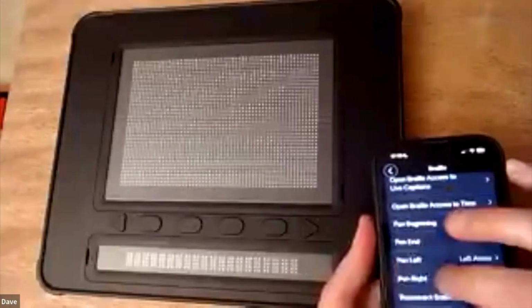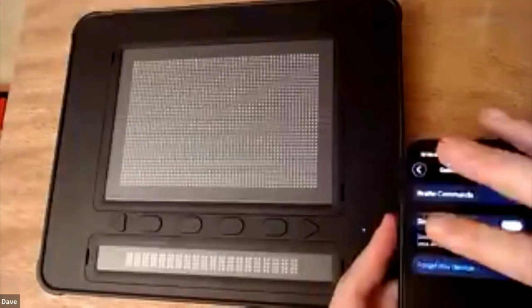So let's go and do that now. I'm just going to do a two-finger scrub to come out of these settings. Braille, button. Braille commands, button. Use underline cursor. Dynamic VoiceOver. Match input and output. English. Unified. Uncontracted. Match VoiceOver. Back button.